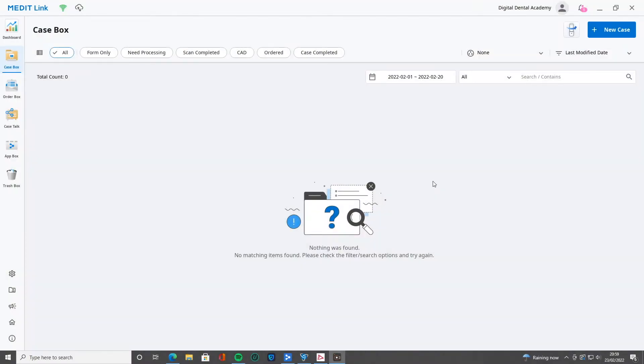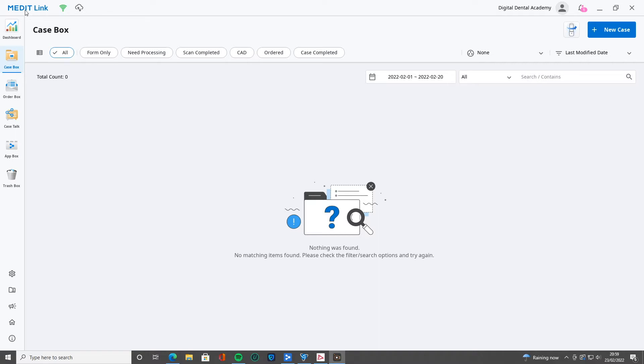Hi, everybody. In today's tutorial, we're going to be following on with our tutorials on MediLink. In our first tutorial, we talked about the basics when you're getting started.